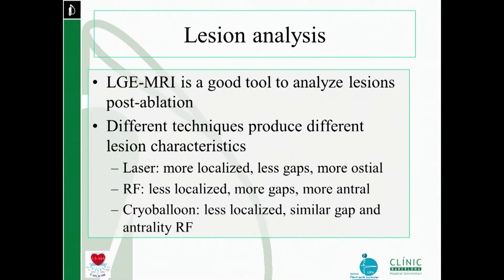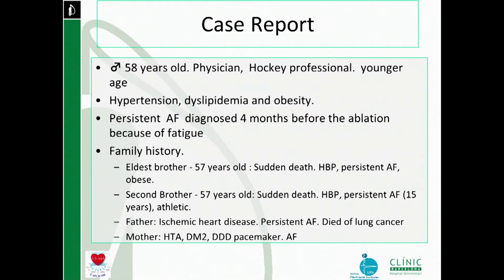So I think that we can summarize that MRI is a good tool to analyze lesions post-ablation. Different techniques produce different lesion characteristics. Laser more localized, RF less localized, more gaps, more antral, cryoballoon less localized, similar gaps, etc. And let me finish with 3 minutes.